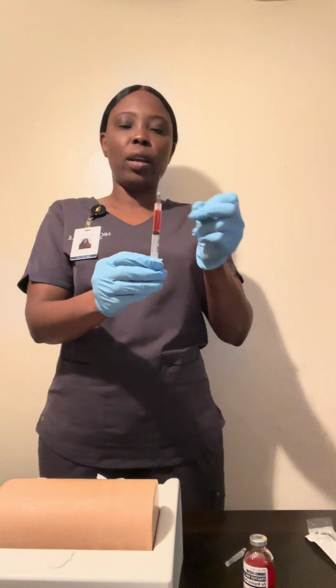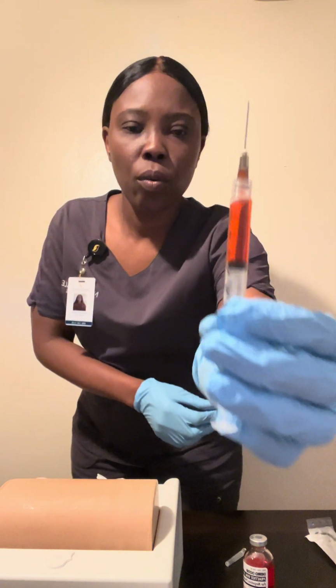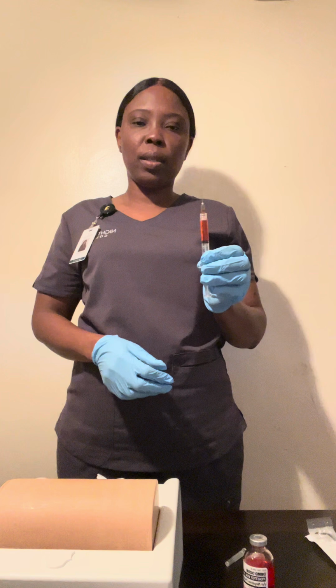I'm gonna check for any air bubbles. This is my 1.5 ml dose.